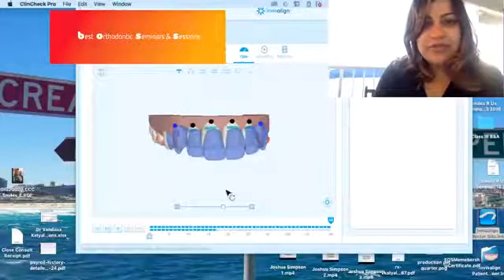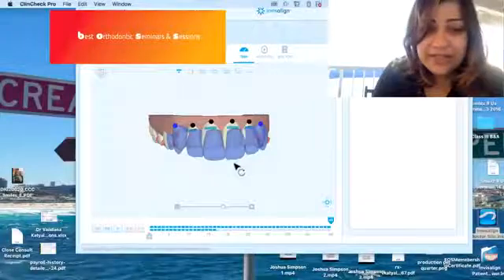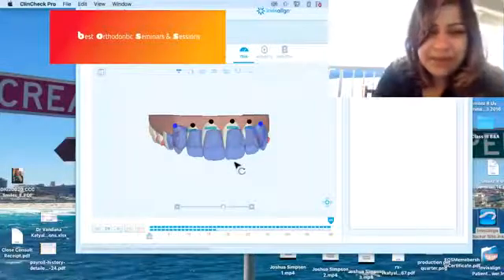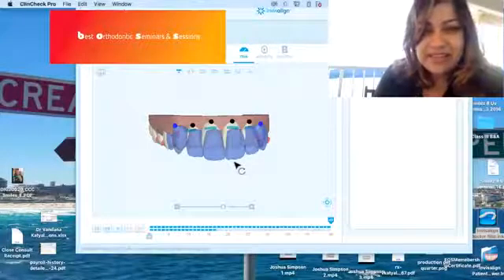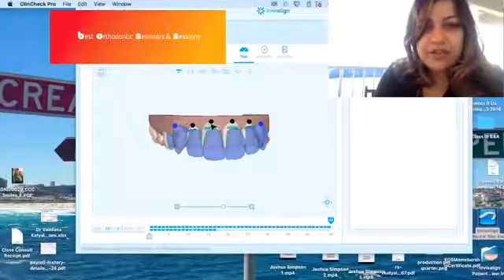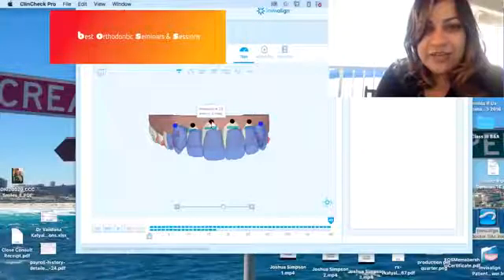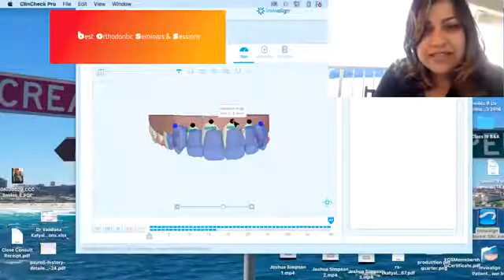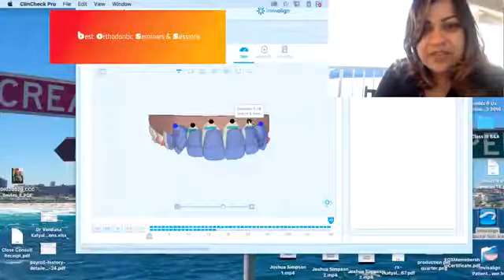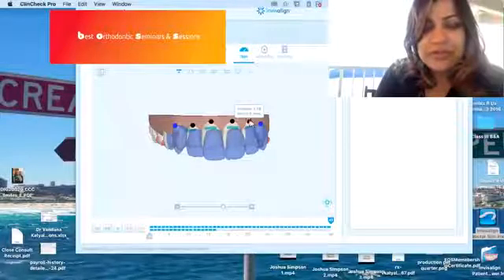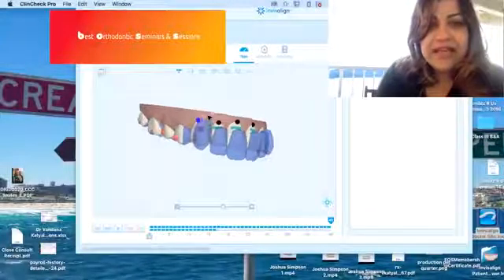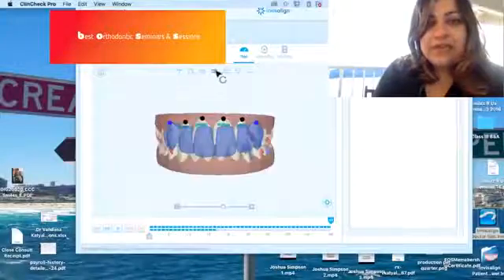5 mm intrusion, that is just way too excessive. Even if it's overcorrected, I think it's the wrong approach here. Those black dots are telling you too much intrusion's been planned here. Those black dots are telling you intrusion 3 mm, each tooth, how much it's been planned.